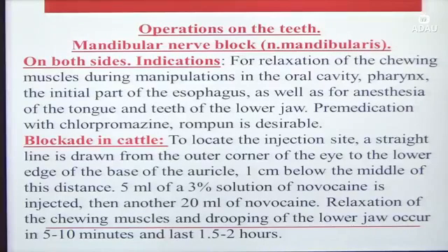For premedication we use chlorpromazine, and we can use Rompun. After premedication, we can see it gives a good result. This anesthesia, and this operation, may last 1.5 to 2 hours.